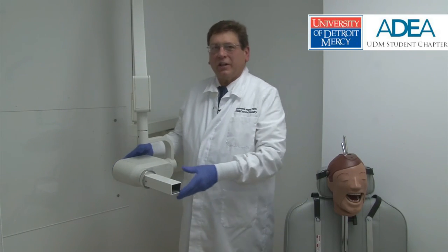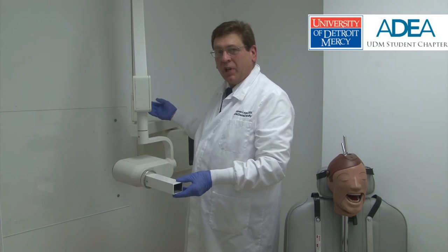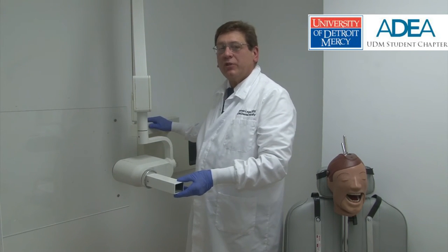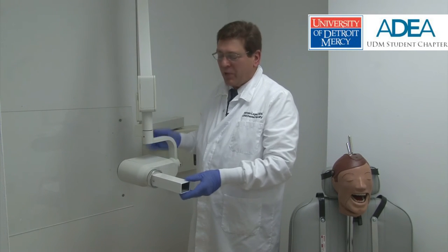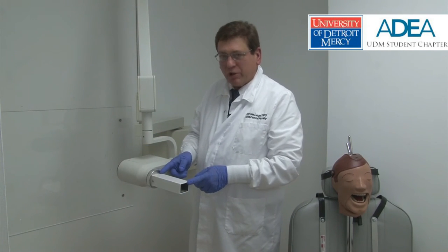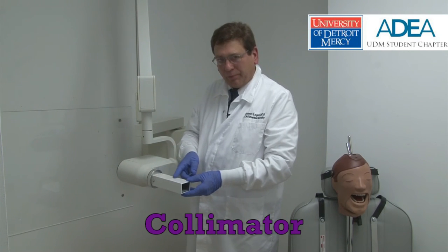So let's take a look at our clinic setup. This is the X-ray head and the X-ray camera. The arm has eight points of adjustment for us to position the head adjacent to the patient's face. This part of the X-ray camera is called the collimator. The root word is column.